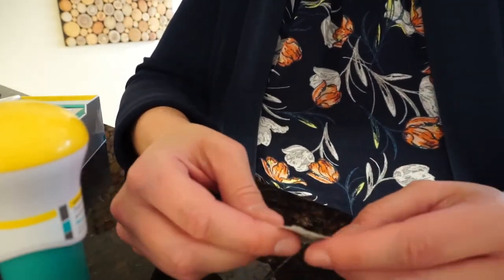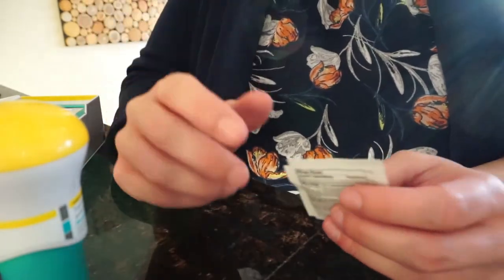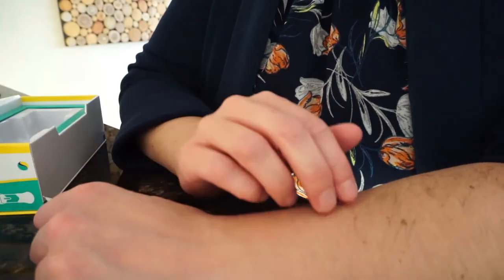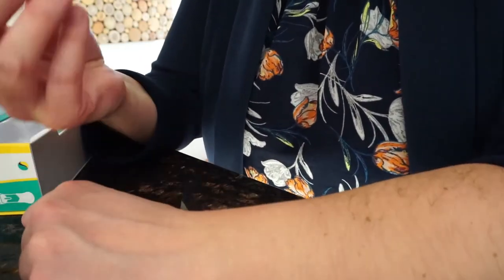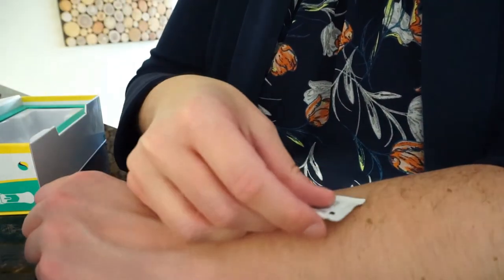For this example, I'm going to use my arm. You never want to inject through damaged skin — like a scab, a rash, or anything like that. First wash your hands, then clean the area with an alcohol prep pad.